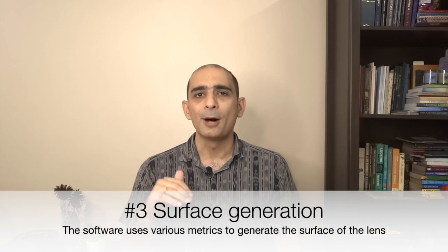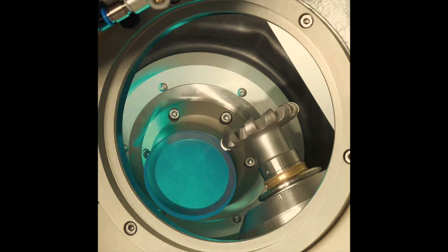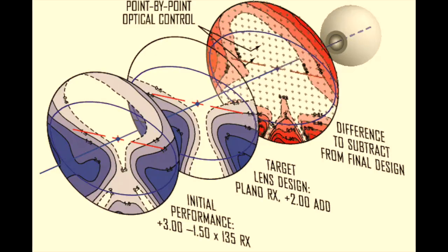Surface generation. A precise and accurate lens surface is generated using computer-controlled diamond tools, which can create the complex curves and shapes required for the progressive lens design.